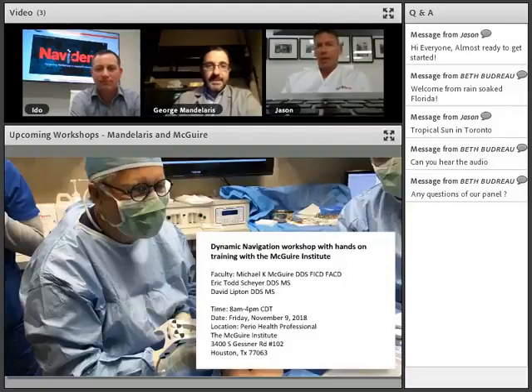Whatever they deem necessary, whatever they feel comfortable doing, they do. Sylvia, for instance, won't guide the implant. Some people guide everyone. But that will be something that comes up, and like anything, the devil is in the details, and it's the scrutiny of what we do to get better.